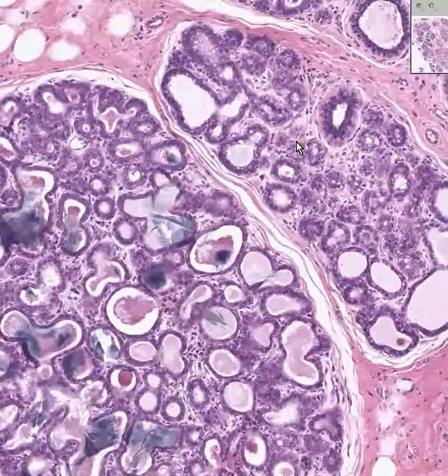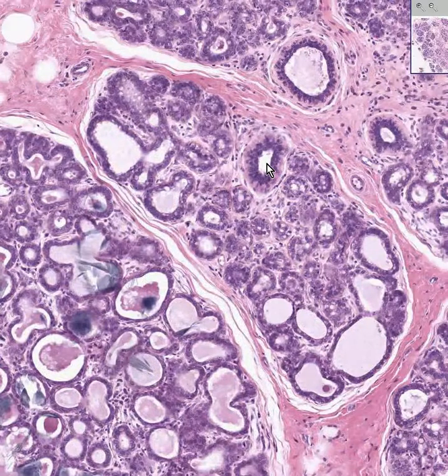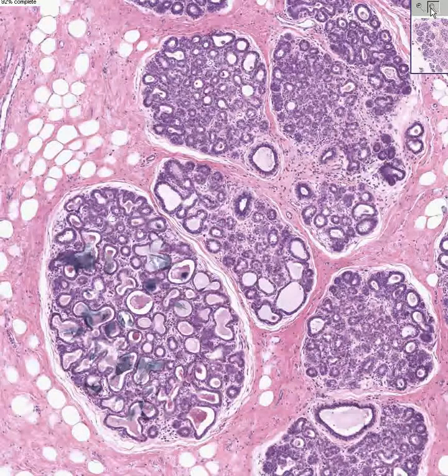We can see a duct inside of one of these lobules, as well as a duct at the periphery of the lobule. Remember, the duct is just strictly transporting the material, whereas all of these acini are actually making the juice. Here's a little blood vessel between the lobules. Here's another one. Here's some fat. Here's some fibroblasts. And you could quickly see that I think we've pretty much nailed down this whole breast.